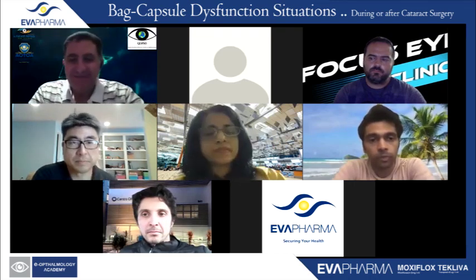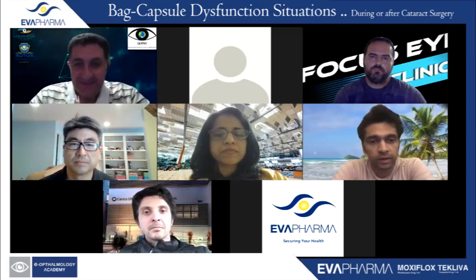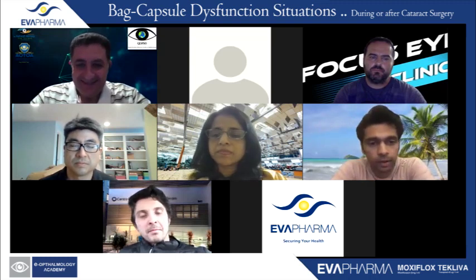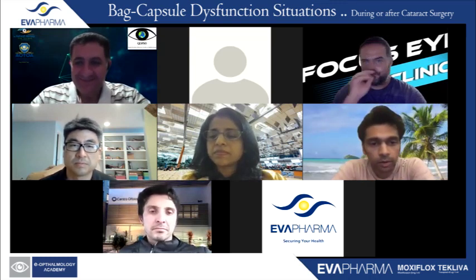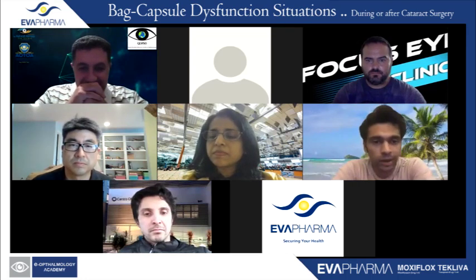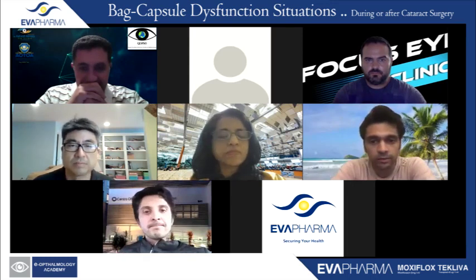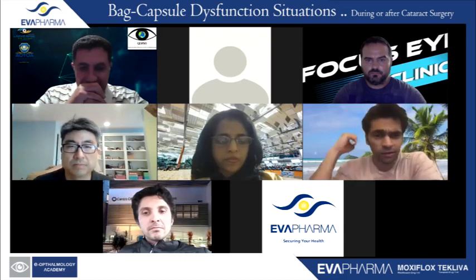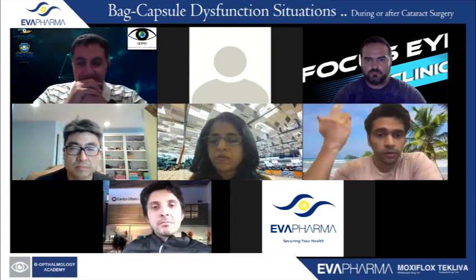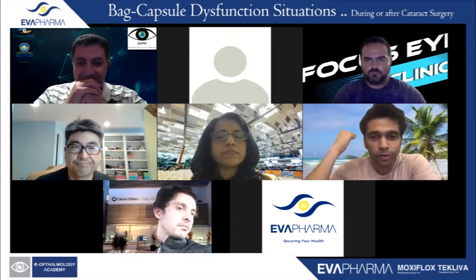Excellent presentation, Ashvin. Brian, that was an exceptional one, and I think it excites all of us to go back. At least excites me for sure to go back and try the Yamani again. The reason probably we don't do it much in India is because we don't have the availability of the PVDF haptic lenses, and that's actually a drawback. And I know that Zeiss is facing a big challenge. They have a backlog from the US itself. So I'm pretty sure that nothing is going to be shipped in the near future, at least.